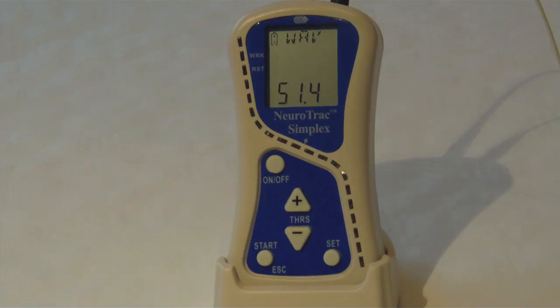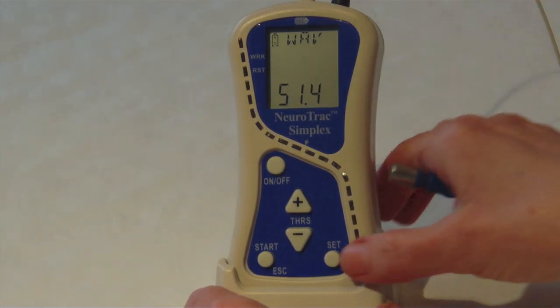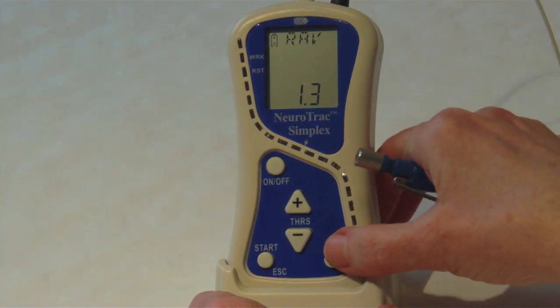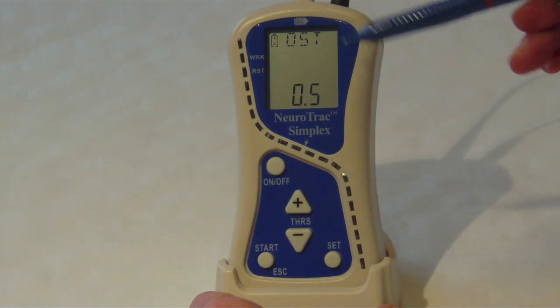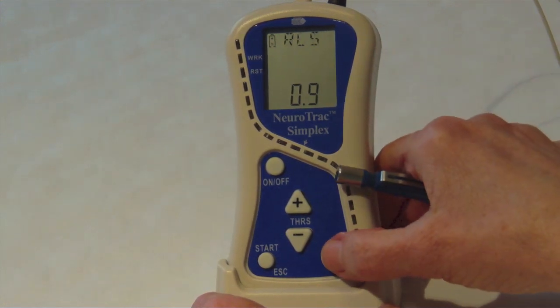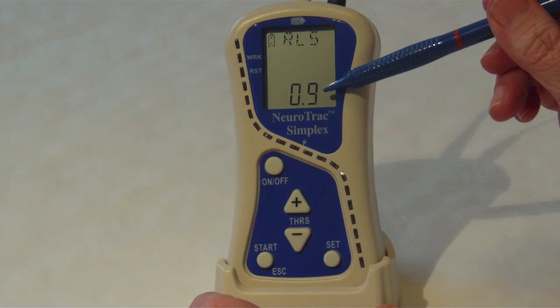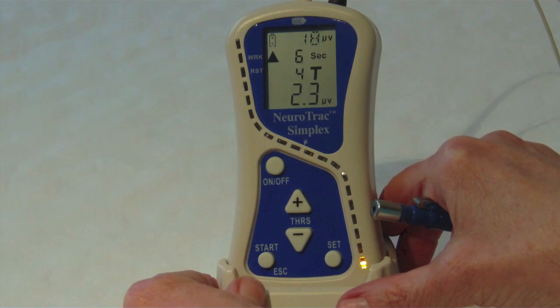Once the trials are finished I can review the results. I can see my work average — press set. I can see my rest average; if a muscle is relaxed this reading should be below four — press set. OST is my onset time: how long is it taking for my muscle to reach its maximum squeeze? This should be less than one second — press set. RLS is my release time: how long does it take for my muscle to fully relax? Again this should be below one second. If you press escape and then start you can begin the muscle workout again.